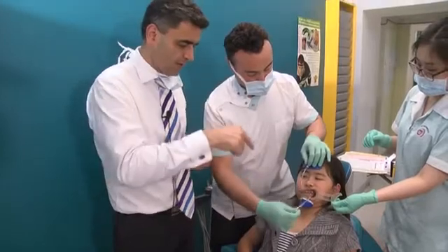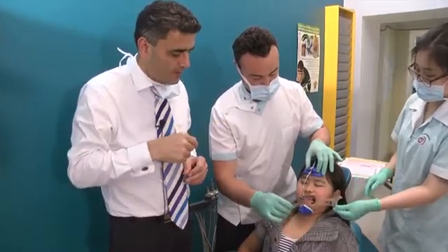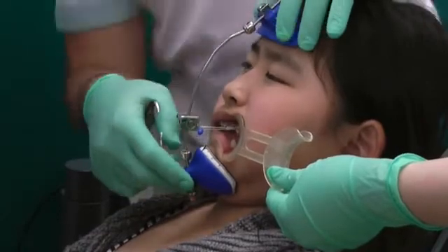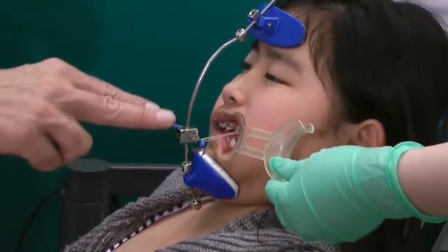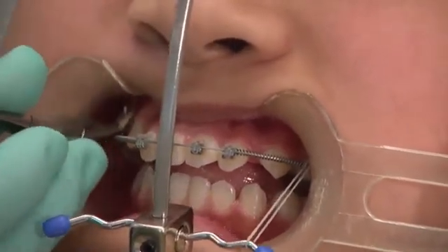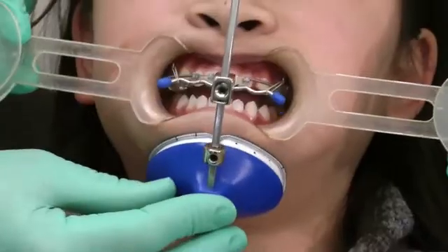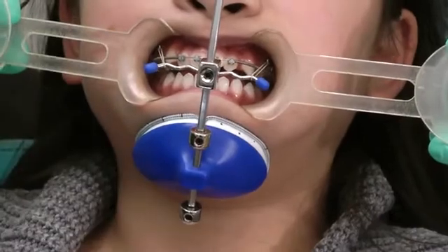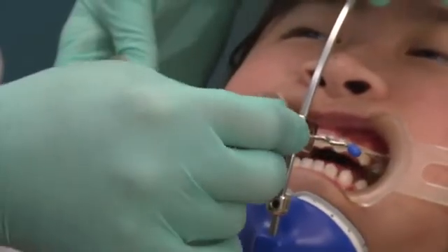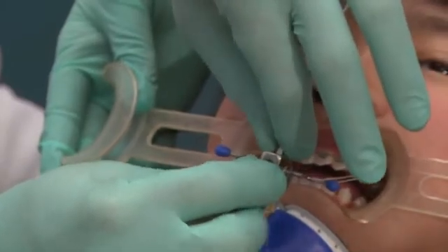Let's look at where the elastic exits the mouth — that's your face mask hook. The elastic will go from there, pulling downward and forward. This force can be measured by stretching it to the mask — we're looking for about 600 grams. The next thing we look at is the vector of force. The elastic may exit too parallel to the occlusal plane, which will irritate the lip and not deliver force correctly. We'll put it on in the wrong position to show you — you can see that's not in a downward pull. So we need to adjust this lever to get it in the right position. Now adjusting to the correct vector: 15 to 30 degrees downward and forward. That's incorrect pulling horizontally out. Now adjusted — that's the vector we want.